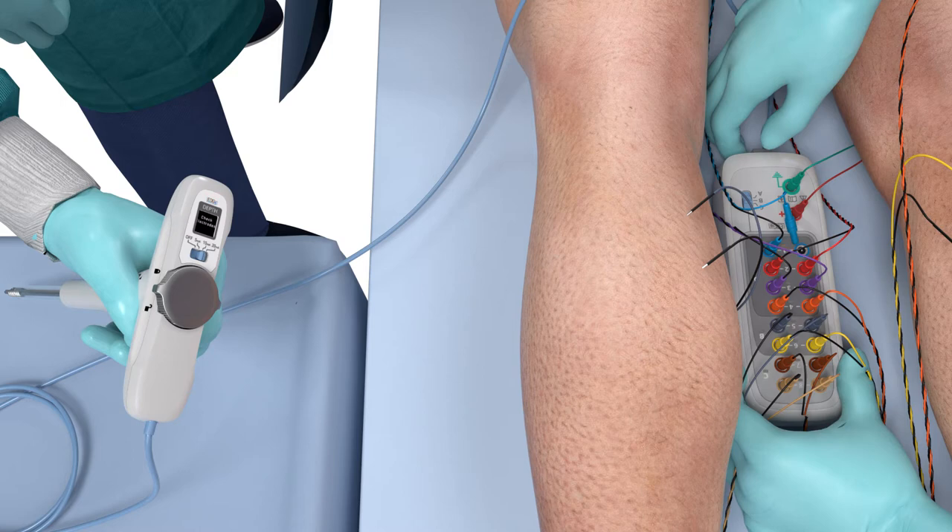If any of the electrodes are not connected correctly, the all-in-one tap and smart junction box will indicate an error with a flashing red light and a 'check electrode' display on the handpiece screen, instructing the HCP which loose electrode needs to be corrected.